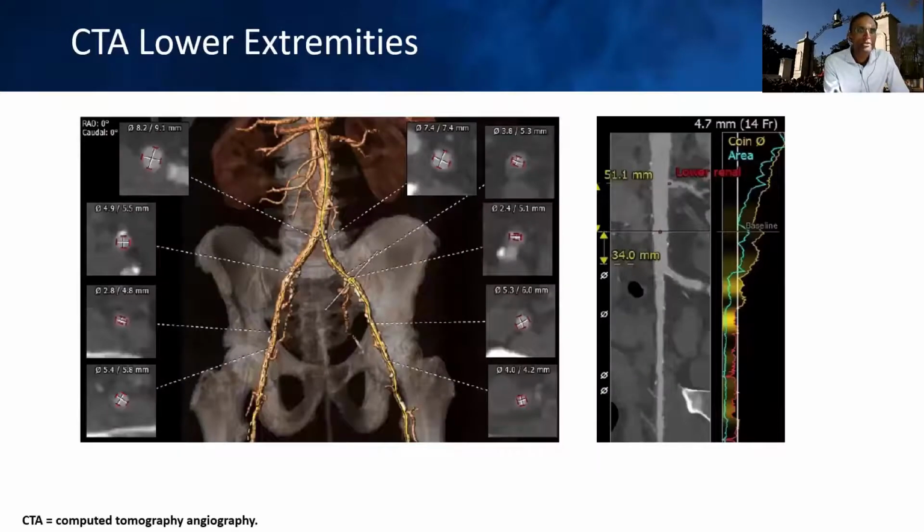Our challenge arose in reviewing the CT angiogram with the lower extremities, most notably, as you can see here, in the lower external iliac on the right and the superior external iliac junction with the common iliac on the left, a marked narrowing in both iliac arteries to below 3 millimeters bilaterally, taking out any possibility of routine transfemoral, or in our opinion, an intravascular lithotripsy facilitated approach.